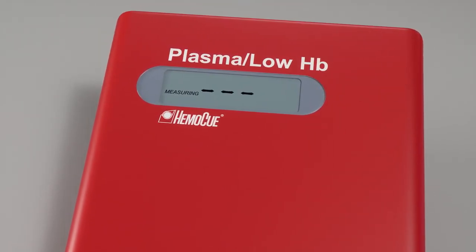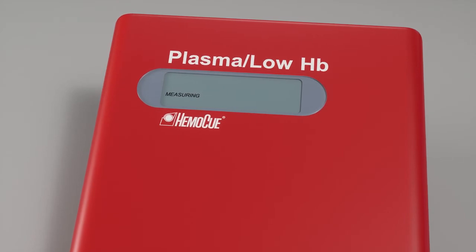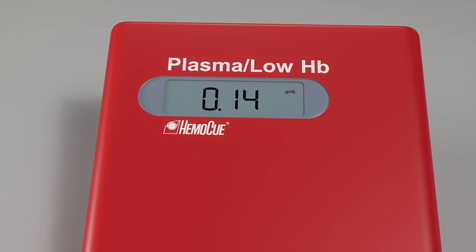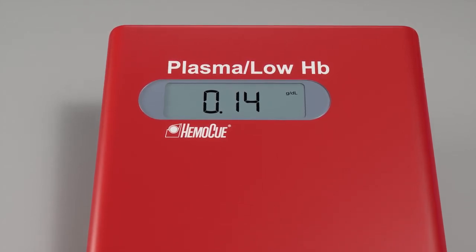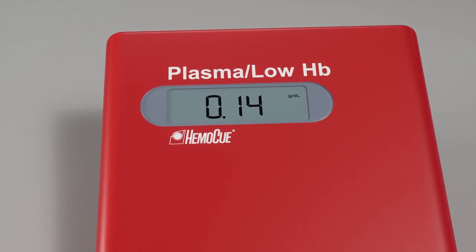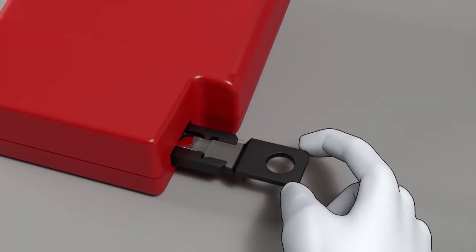Measuring and three flashing dashes is shown on the display. The result is displayed after 15 to 60 seconds. The result is displayed as long as the cuvette holder is in measuring position. Discard the micro-cuvette after measurement.